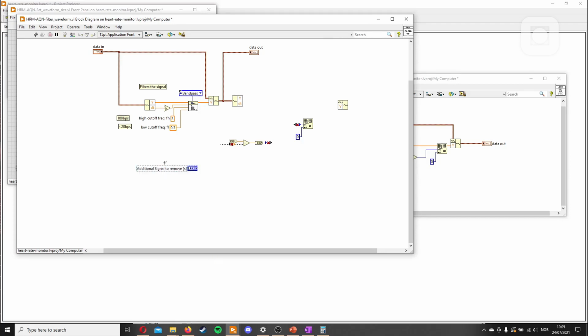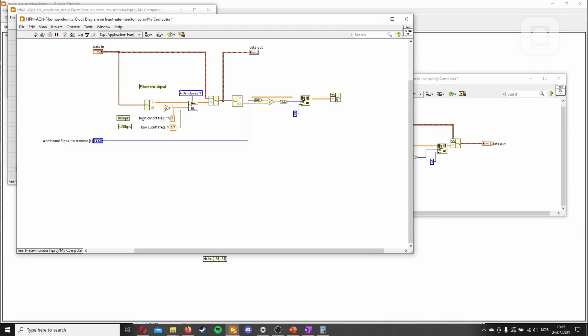Okay. And we like to have indicators on the left side, so it might seem a bit strange to have it this far away and overcross everything, but it's easier to view when you have every indicator on the right side and the inputs on the left side. The same as last time, we'll put the signal in here, and this will remove the amount we request with this one from the signal. And then we put this back in here. And put the waveform in here. And the output waveform should be this one.